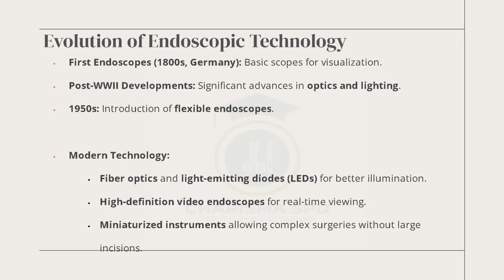Then miniaturized instruments, allowing complex surgeries without large incisions. So you can puncture a hole, pass an endoscope through it, and you can also pass other tiny instruments through the endoscope to do some manipulation in the internal organs of human beings. It looks abstract.